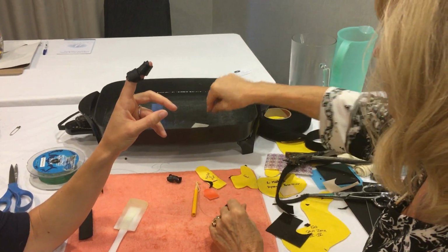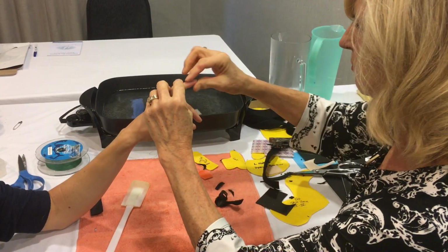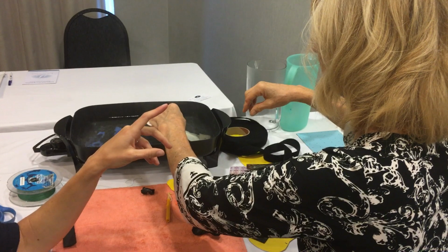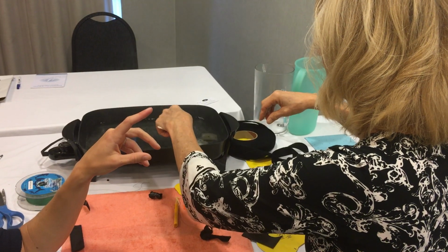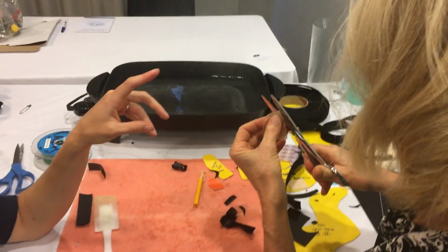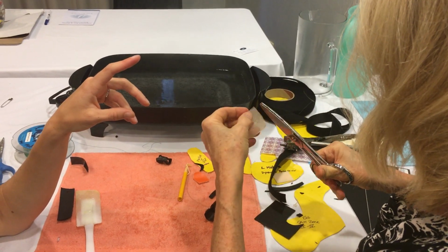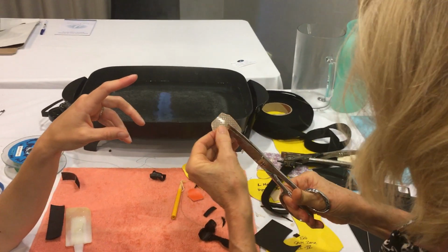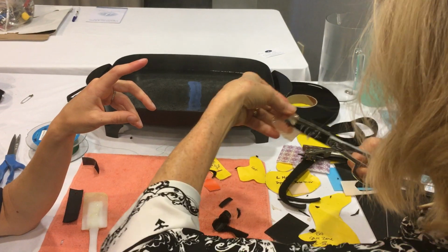Okay. So I am going to remove this until I get that piece in place. If it was a patient, I might do something to keep that DIP joint extended. And I'm just making it out of a different color so you can see it better. But you could use the same thermoplastic material that we used. And I'm actually going to cut this hole. I punched it with a hole punch, but I actually wanted a little bit bigger. So I'm just using the scissors to trim that hole a little larger.